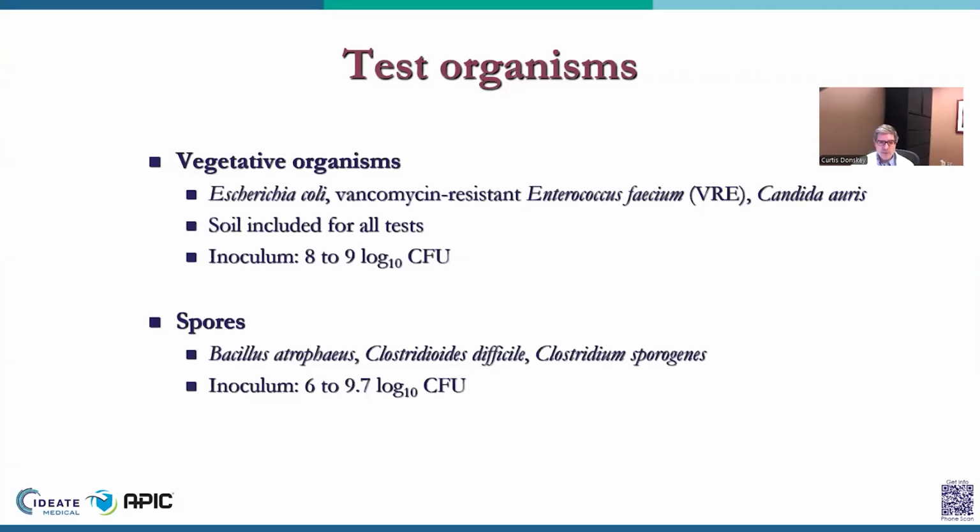And then for spores, Bacillus atrophaeus, C. difficile, and Clostridium sporogenes, again with 6 logs or with higher log challenges beyond the FDA requirement. Next.